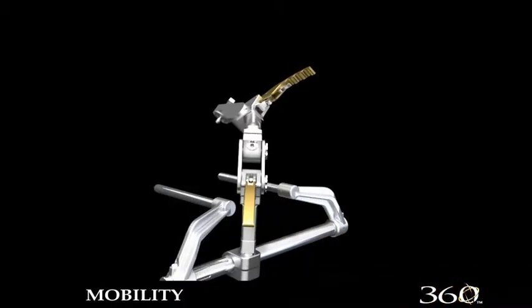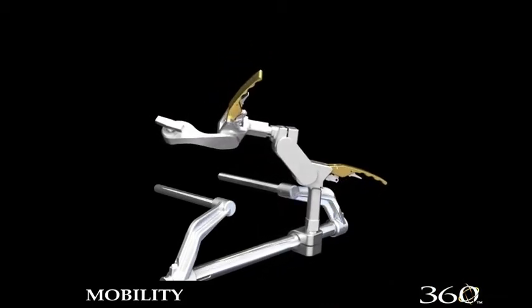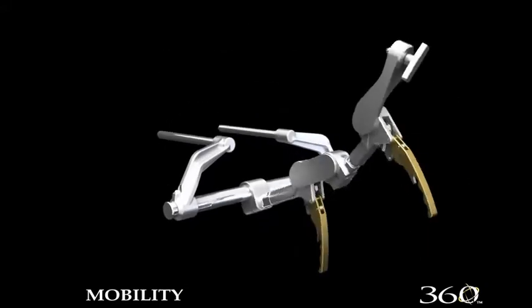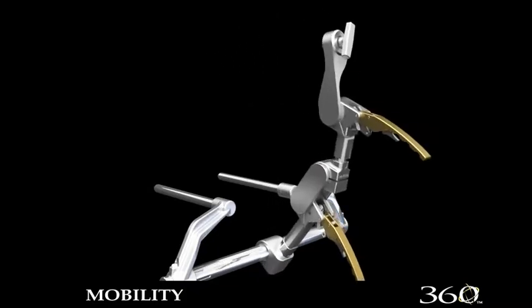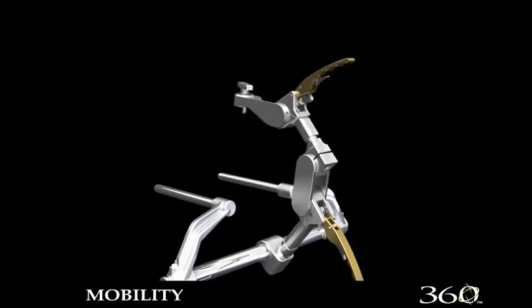The Ultra 360 has remarkable movement and mobility. With both rotating locking handles in the open position, the 360 has the ability to rotate around the horizontal support tube, rotate at the end of the first handle, again at the second handle, and up at the top near the adapter component. Each of the handles is also split to provide rotation.